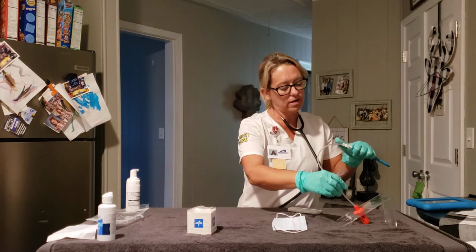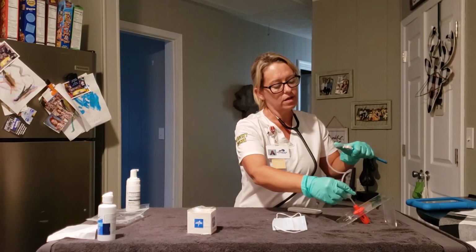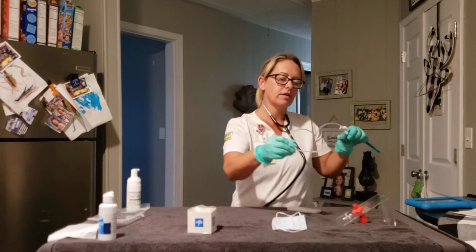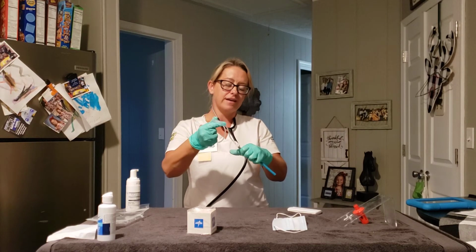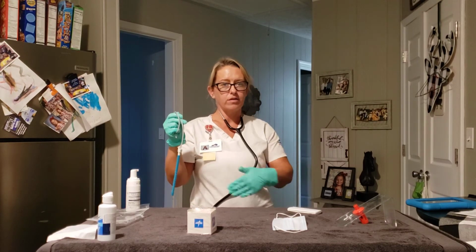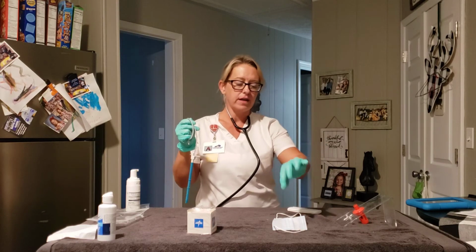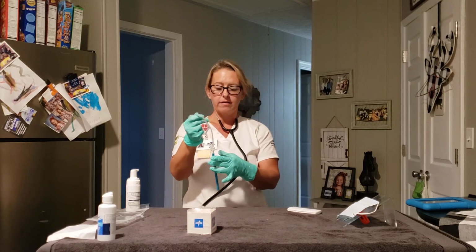I'm going to go in till I meet resistance, till she coughs. Okay, she is coughing, so I'm going to go ahead and pull out. Okay, I'm going to go ahead and check her O2 again. It has come up. I'm going to do her lung sounds again. They sound clear, so I am happy with it. I'm going to go ahead and put this back on so she can oxygenate while I clean my mess up.